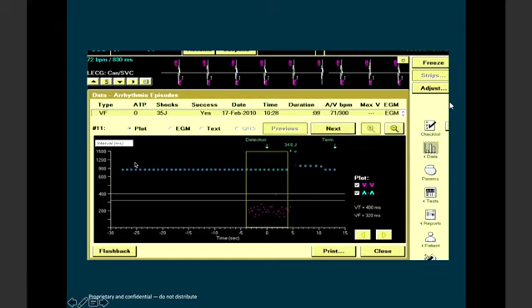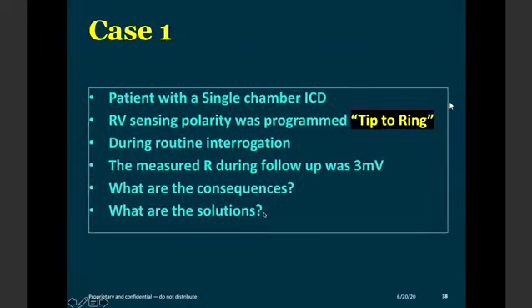This is another example of an interval plot. Both are the same. Atrium and the ventricle are slower here. Suddenly you see that the ventricular rate has become very rapid, and this falls in the ventricular fibrillation window. And what has happened thereafter? A 34 joule shock has been delivered, and the tachycardia has been successfully converted, and the atrial P and the QRS are now having a one-to-one relationship. This is called an interval plot.